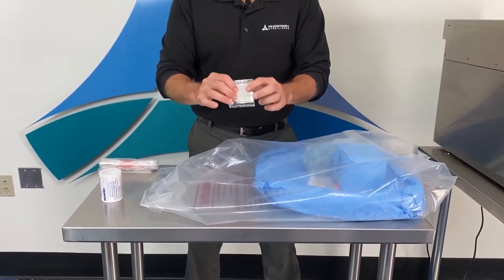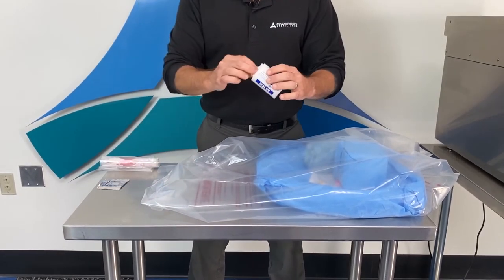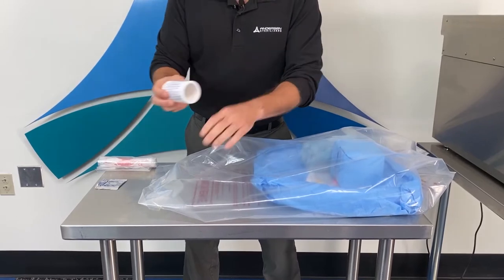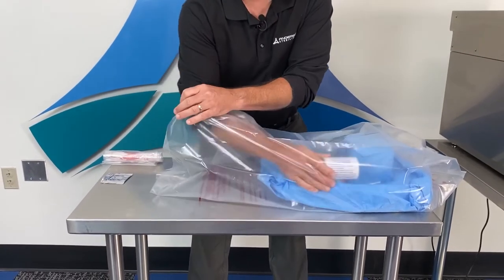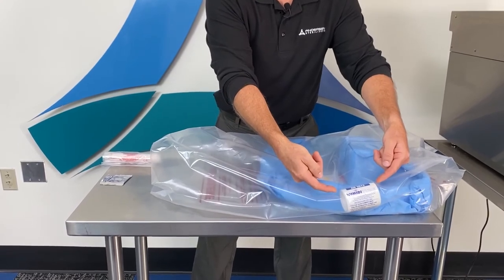Your third item will be your humidichip. Remove it from the packaging, place the humidichip on the side of the load with both sides open for proper airflow.